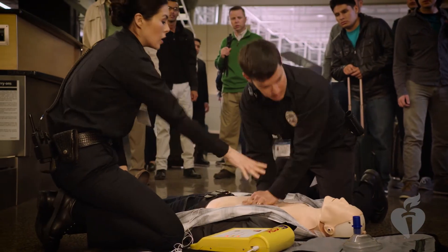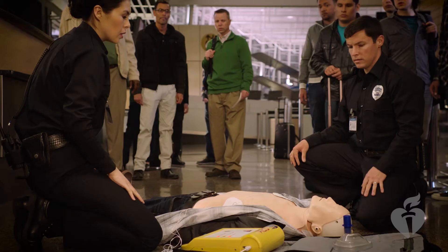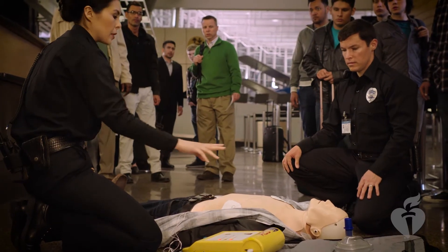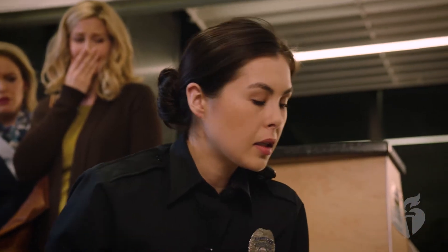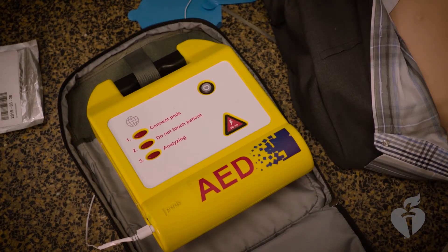Do not touch victim. Stop compressions. Clear the victim. Shock advised. Charging. Do not touch victim. Keep clear. Press the shock button now.